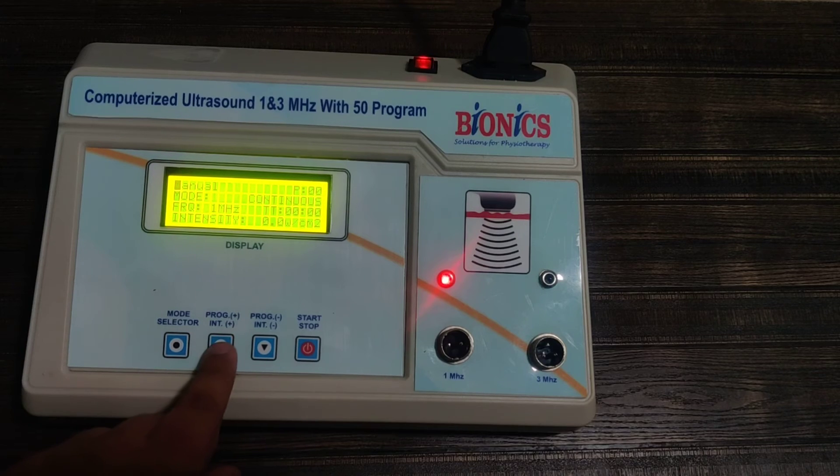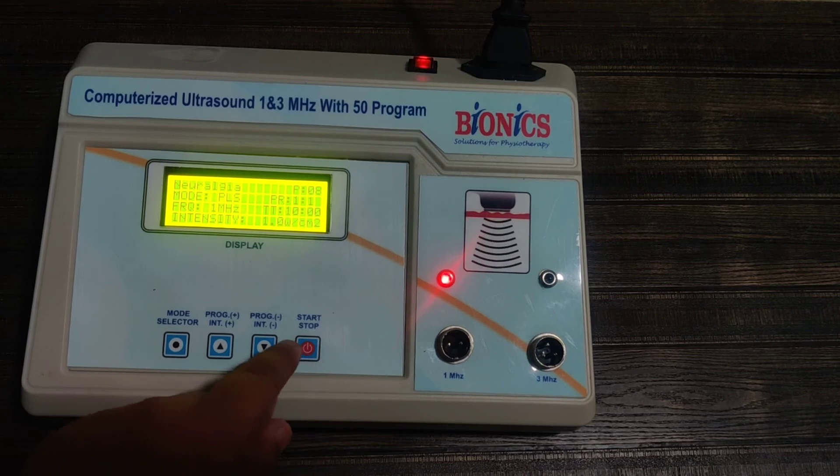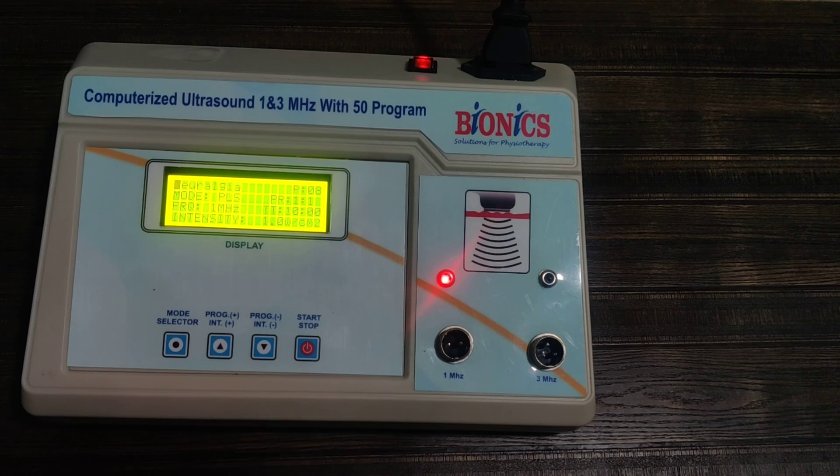If you wish to use the programs, you need to bring the cursor to manual and then select the programs. According to the program, the machine will show you which probe to be used — 1 or 3 megahertz. There are many programs available. After selecting the program, you just press start and can increase the intensity.